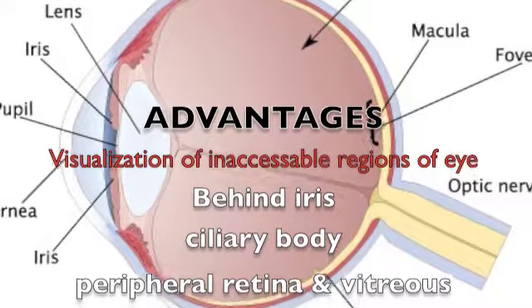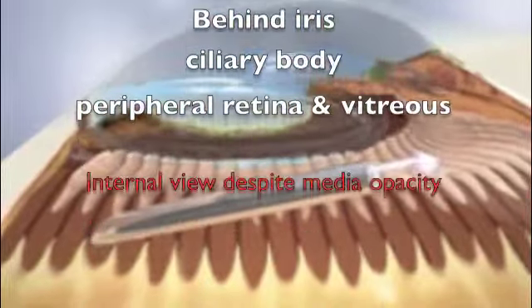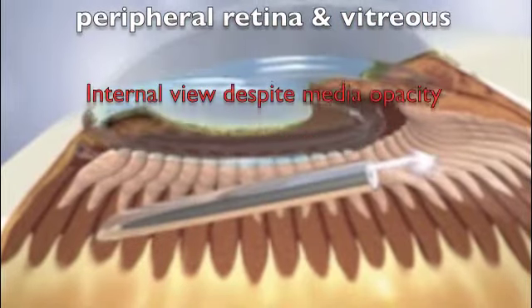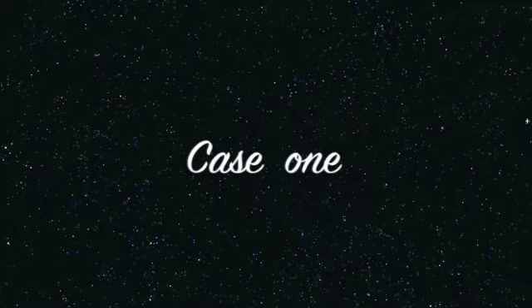The endoscope opens up this region of the globe for diagnosis and treatment. In patients with opaque media, endoscopy makes vitreous surgery possible. I'll show you two case scenarios where endoscopy has helped in managing the patients.